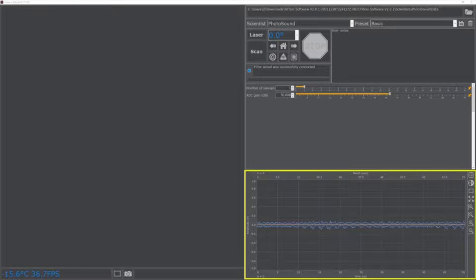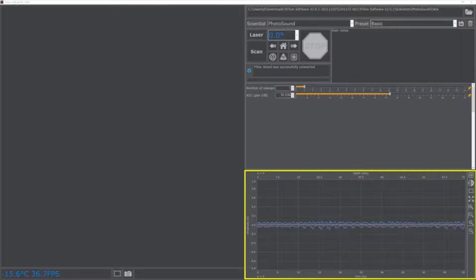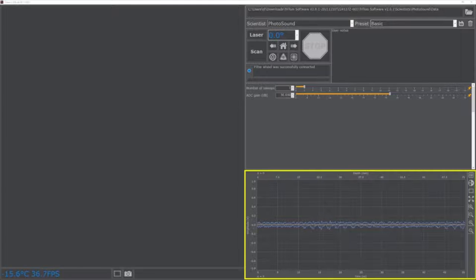The blue plotline displays the maximum and minimum values of all channels across all ADCs. If the photoacoustic signal surpasses the ADC limit, the blue channel turns red to notify the user that the acquired signal is saturated.